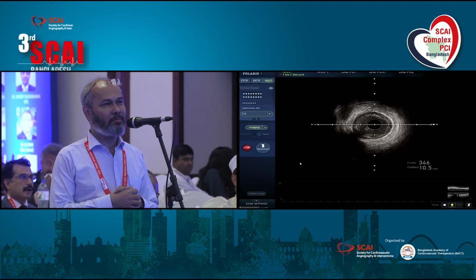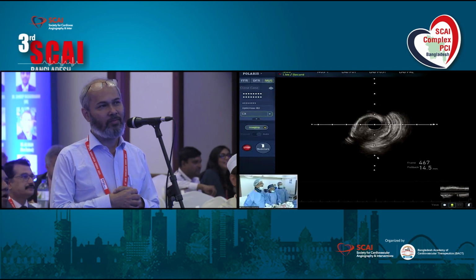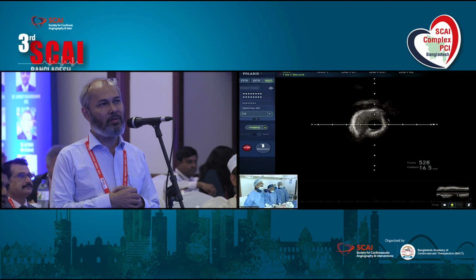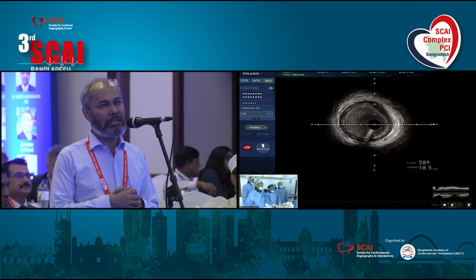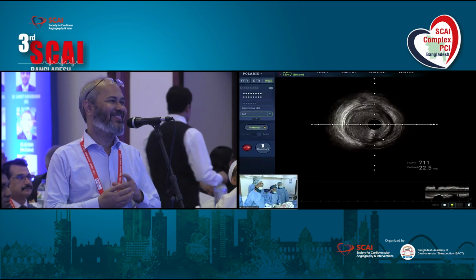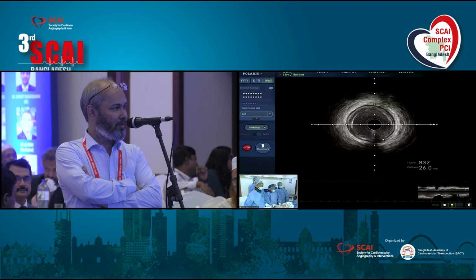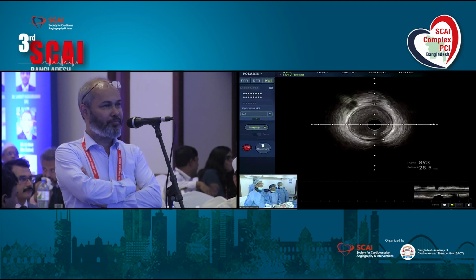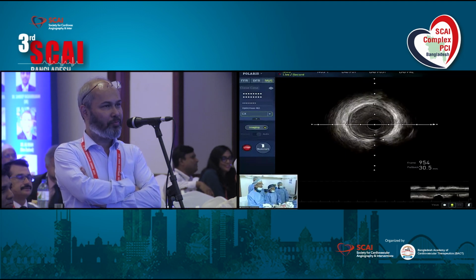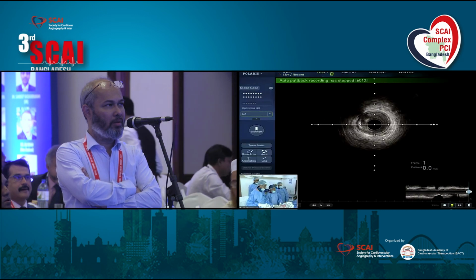Now you see the LCX. This is a pullback of the IVUS from the LCX, distal LPDA. I think if there's already an IVUS on the table from the LAD, we should use it. It's media to media almost 3 millimeters distal. Okay, that's enough, I think, because of time. Otherwise we can review the IVUS.